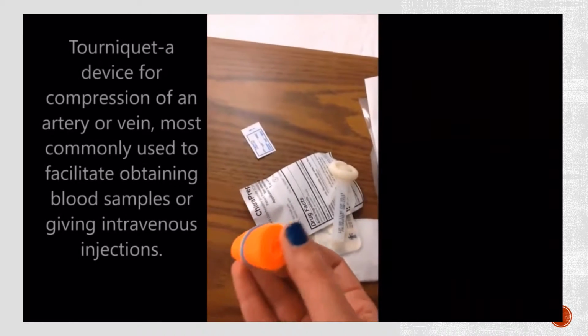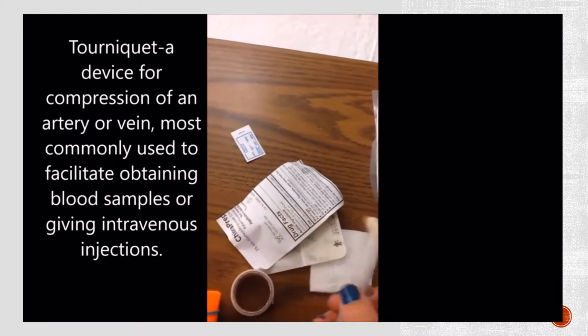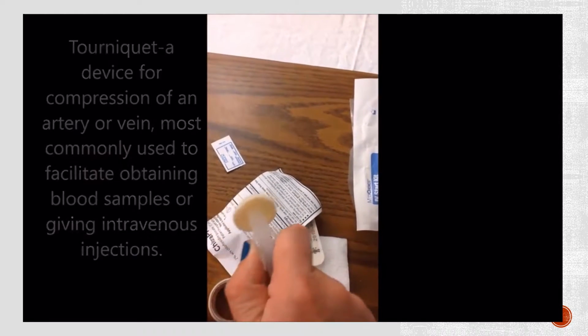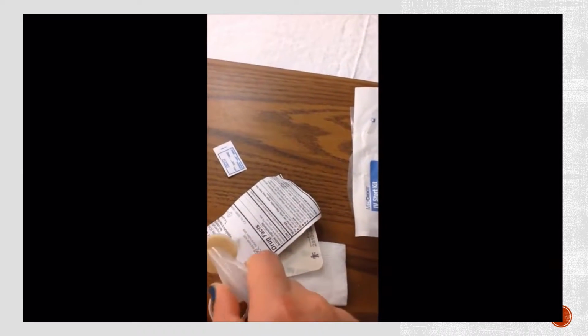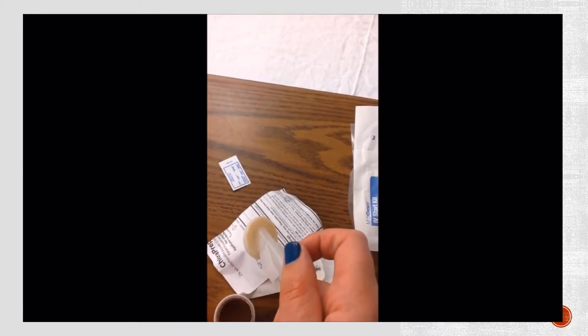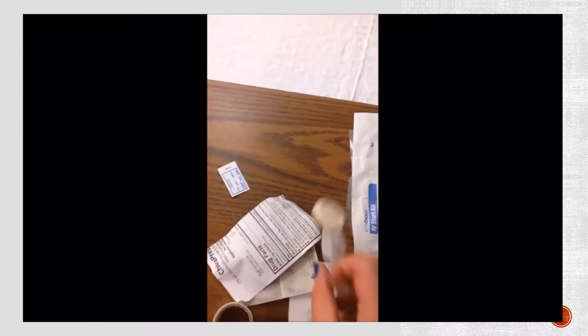In it you will find your tourniquet, your alcohol, and to use this you have to snap these two things, and then you shake it a little bit and you clean the area, and you'll clean in a circular motion and inner to outer.